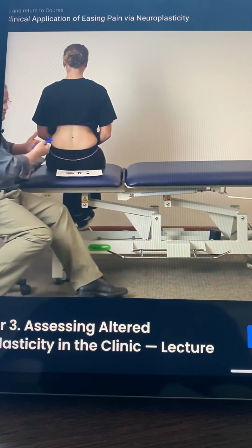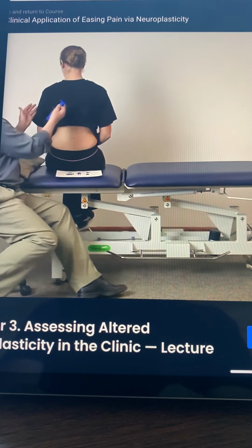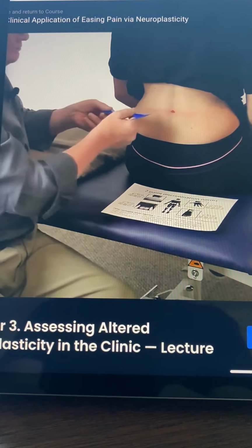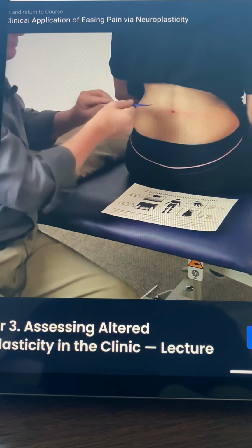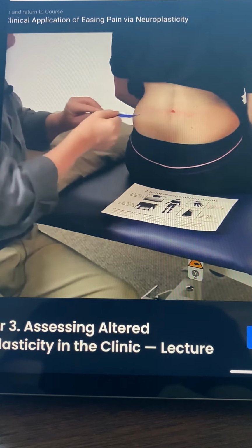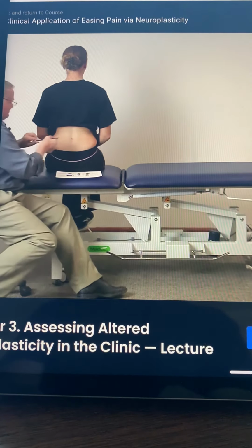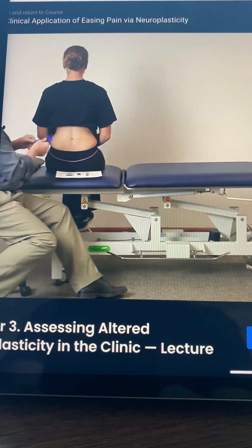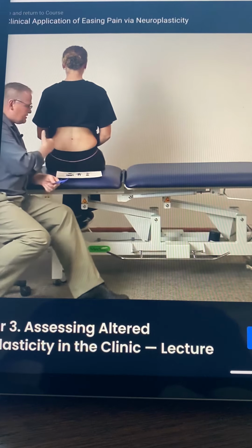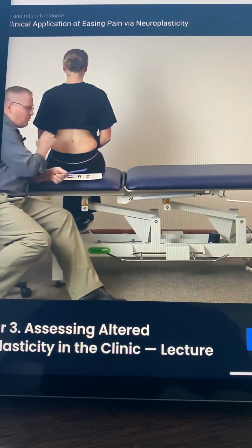We will now come to the other side, her involved side, where she has back pain, and also do the test. We're going to do it on the left side, Heather, and just let me know if it's 1 or 2 points. 2. 1. 1. 2. 2. 1. 2. And in this case, her affected side has the same value as the other side. She would now have a 2-point discrimination value of 5.5 centimeters.